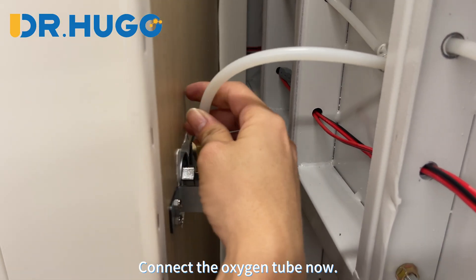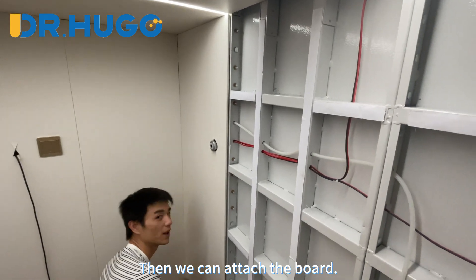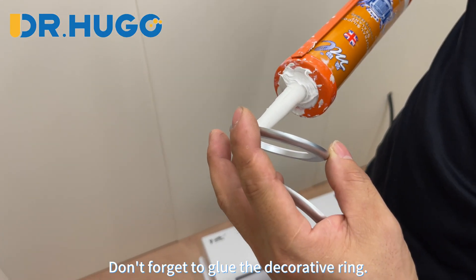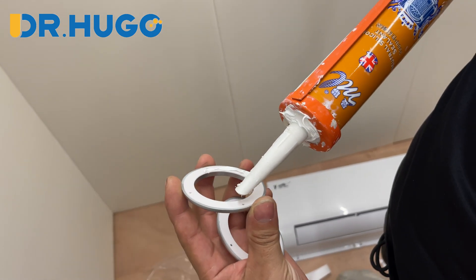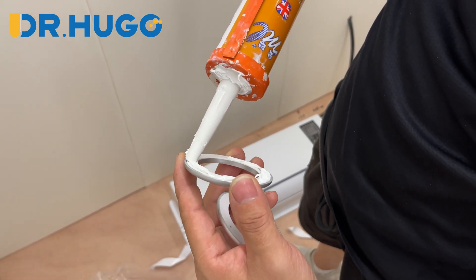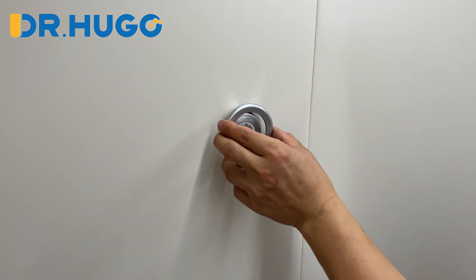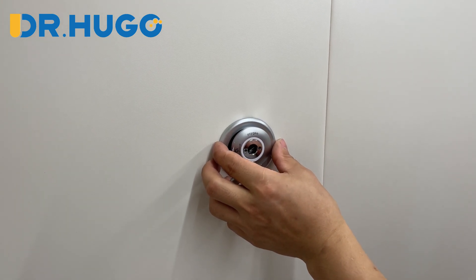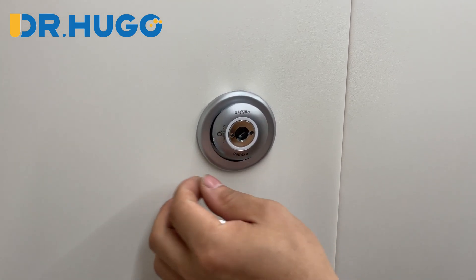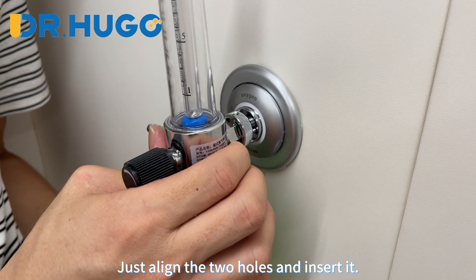Connect the oxygen tube now, then we can attach the board. Don't forget to glue the decorative ring — no need for too much glue or caulk. Then attach the ring on the connector. There are two holes on the connector; just align the two holes and insert it.